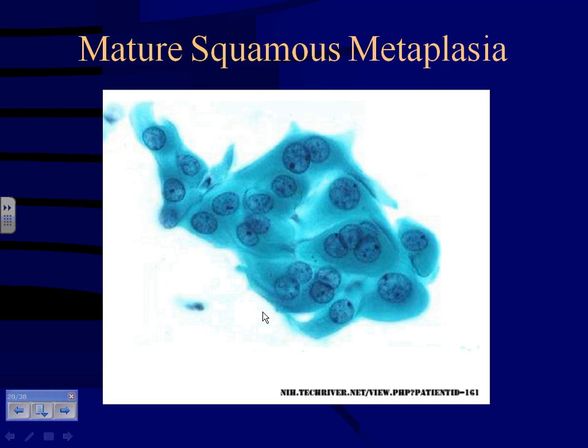Here's another example. Now here the cytoplasm is very dense, and that's a good squamous feature. Some of them are multinucleated, which they can occasionally be. Here you start to see some projections off of the cytoplasm. The nucleus, again, is uniform throughout, except for, obviously, the ones that are multinucleated, which is a little bit different, but still the chromatin is regular. There are indistinct nucleoli. And this is another good example of squamous metaplasia.